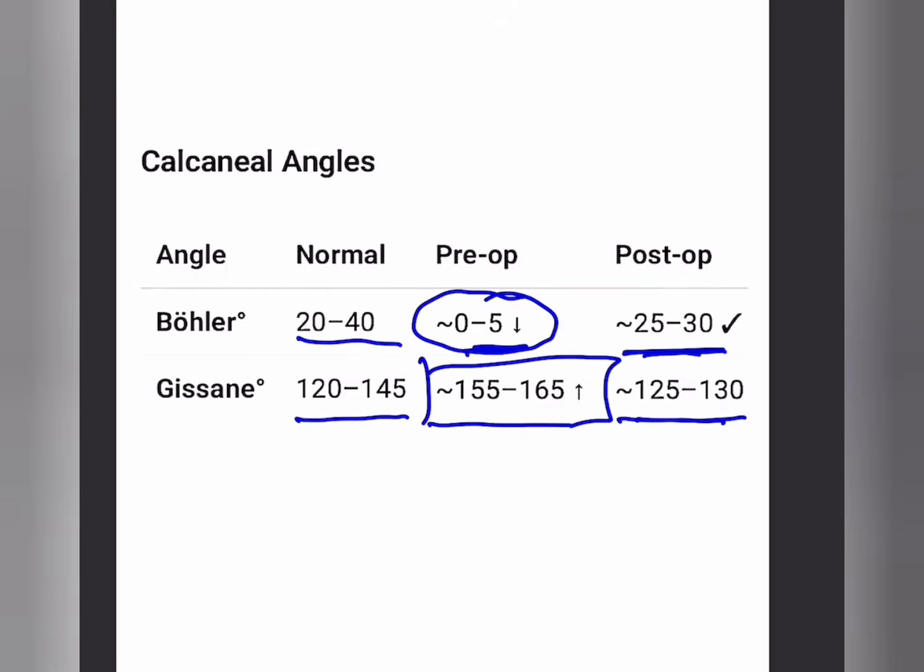So in calcaneum fracture, or any day, you need to take care about the wound complications, right? The patient selection and the modality absolutely depend on meticulous preoperative planning of all the inclusive factors, including the general condition of the patient. I hope this video was useful in understanding the salient concepts of calcaneum fracture fixation. Along with that, what all factors you need to take care of before operating a case of calcaneum fracture, and how you operate a case of calcaneal fracture intraoperatively.